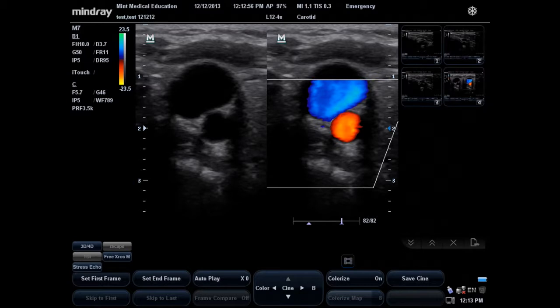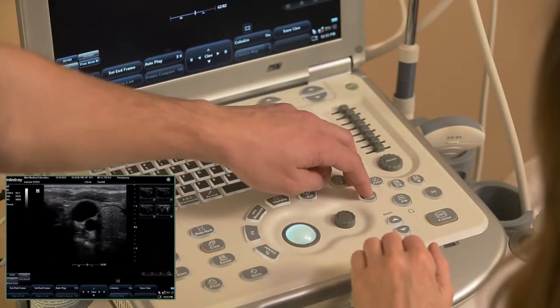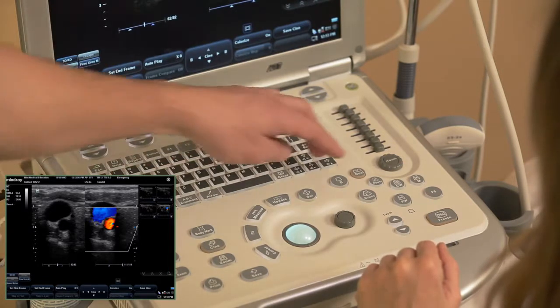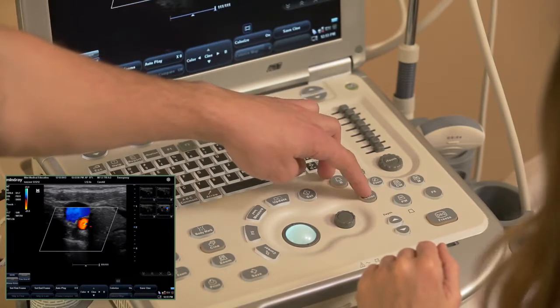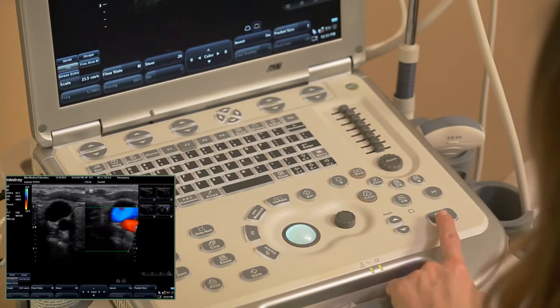Yep, and I see that you're saving some images over there. And so every time you save, you'll see them start to populate over there as little thumbnails on the right side of the screen. Okay, right here. Great. So then can I pull off color? Probably not. So if we hit color, it'll just pull you back to a single. Okay. Yep, and if we came back to dual, that's actually a post-processing where you have the ability to go between regular dual with it on and off. Exactly. So you can kind of jump back and forth between all those modes, whether you have it dual with color or just a single image with color or without color.